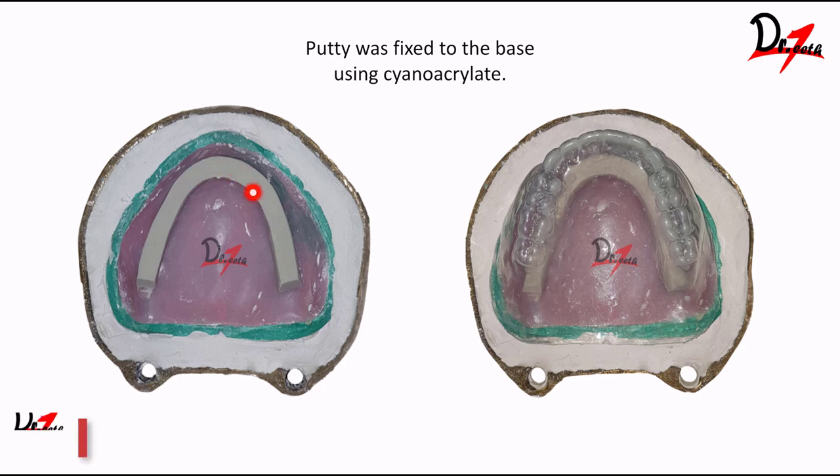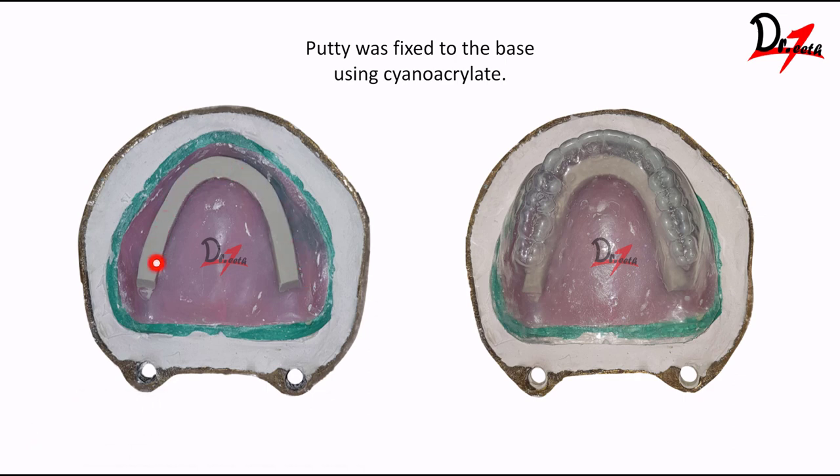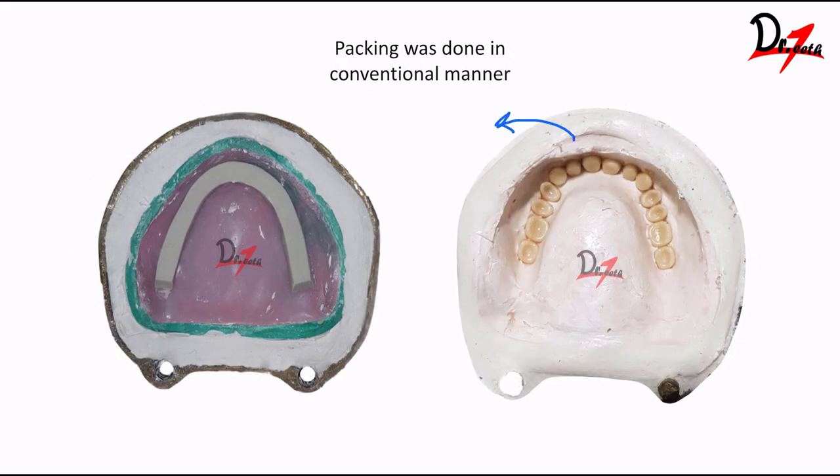Once we know the amount of space available, we take a putty elastomeric material, adapt it in a U-shape on the record base, and fix it using Feviquik or cyanoacrylate. Then we place the template on top again to check that we have enough space for the acrylic material. We mix heat-cure acrylic and process the denture as we normally would. But now, since we have putty in between, this will make the denture hollow. After processing, we remove the putty by creating a hole in the posterior side of the denture.